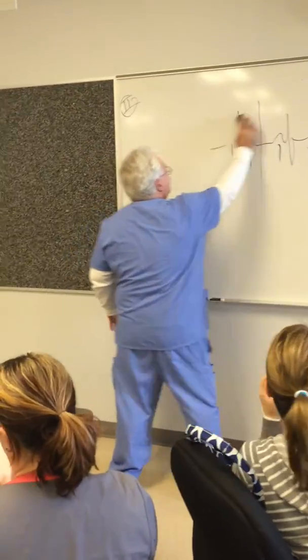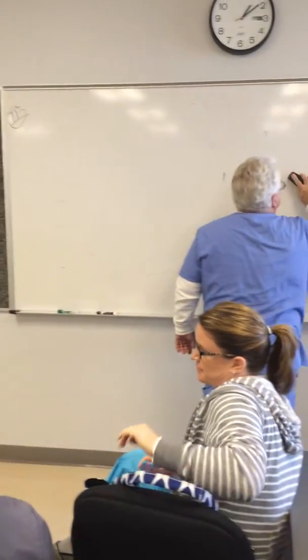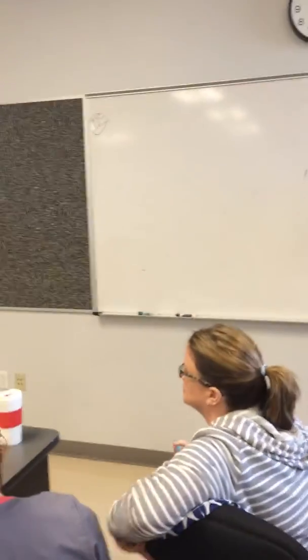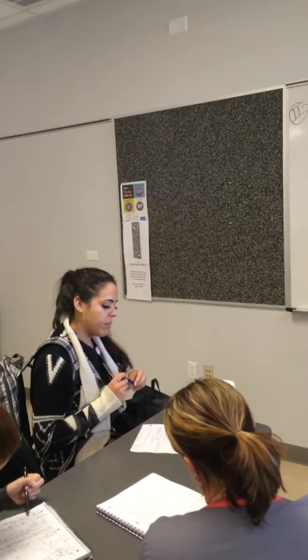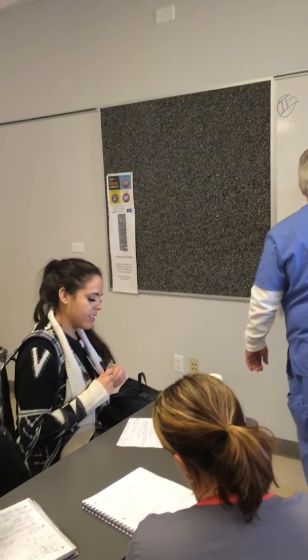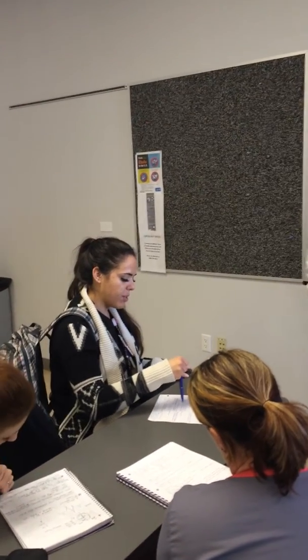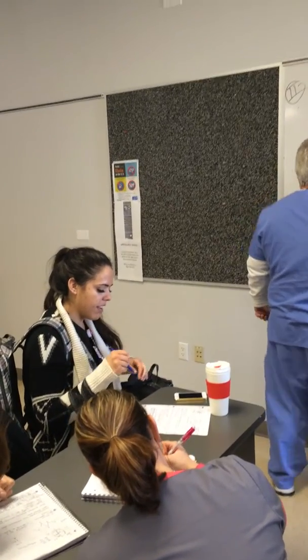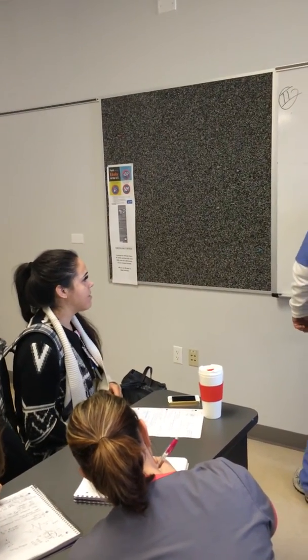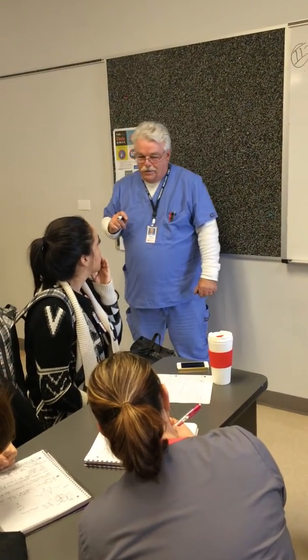Okay, can we go over the third question that you asked yourself? Sure. Is there a P wave prior to QRS? Correct, that's the first part of it. 3A, is there only one P wave before QRS? B, is the PR interval 0.12 to 0.20, less than 5 boxes? Right. I'm missing the last one. Is the PR interval the same? The PR interval is constant.